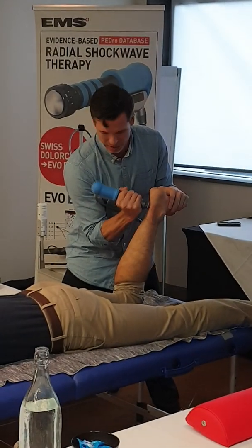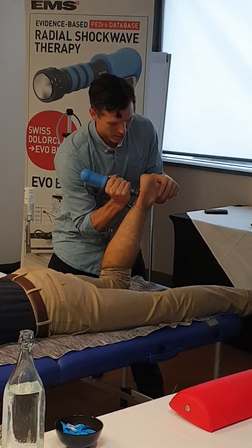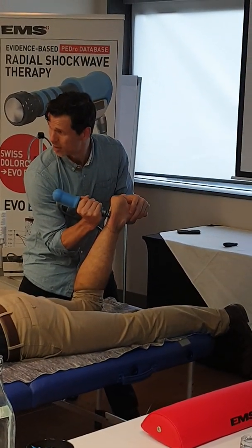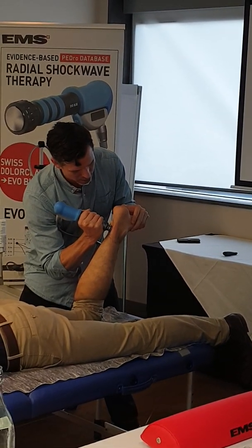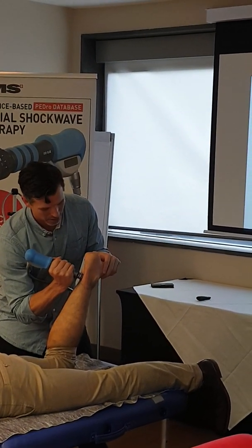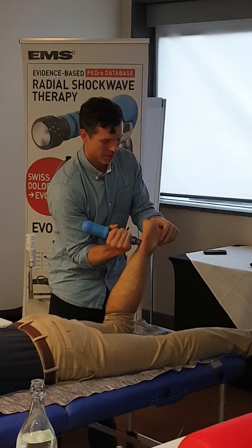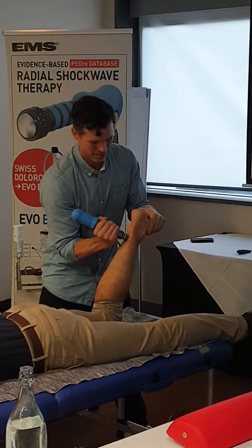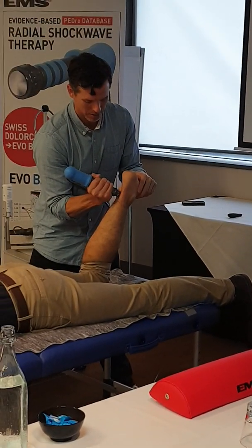Worst here, though. Worst here, then up here. So again, you just ask, am I applying a lot of pressure? I'm not. I'm really just trying to feel. Does it look like I'm pushing hard? No. You can see by the two silver rings on the tip that I'm not compressing. You can still see them. So you can tell I'm not compressing because you can see those rings.